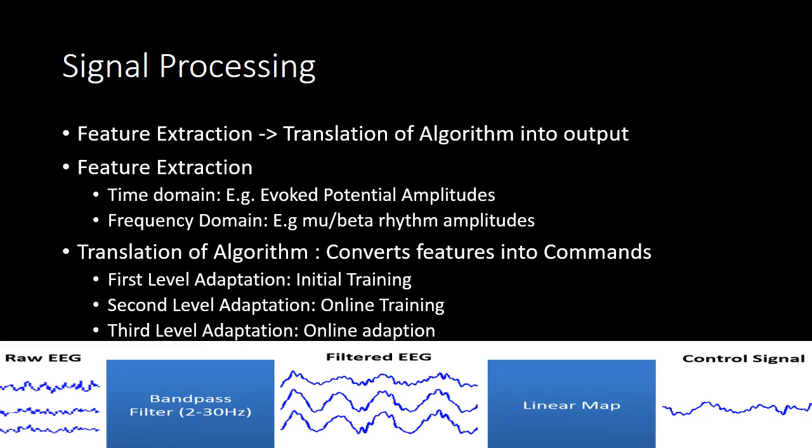Second level of adaptation is the adaptation to the variations due to the temperature, due to the hormone level, due to the fatigue or illness. And third level of adaptation that the controller must adapt is knowing the fact that the BCI system is basically the cooperation between two adaptive controllers. The brain is also an adaptive controller. It changes its response a little bit to same stimuli. So that is why the BCI controller should also take into account this adaptivity while implementing the algorithm.